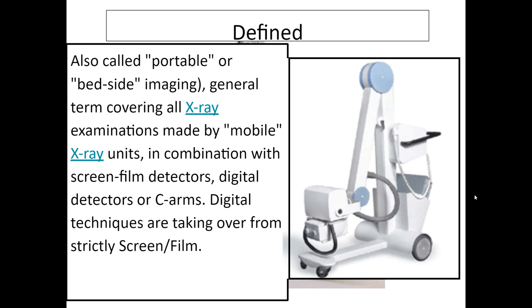So this particular portable, I used something much worse than this. This is considered a mobile unit because it's got an x-ray tube, but where is everything? You know, what we're used to looking at is this big boxy unit. And the reason we don't see it here is because there's no battery in this portable machine, which means it can be a lot lighter and it's less bulky.